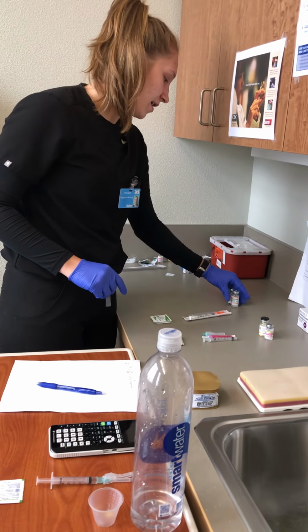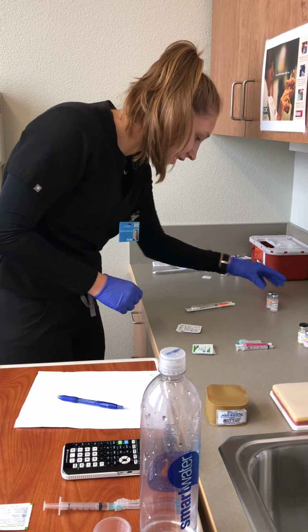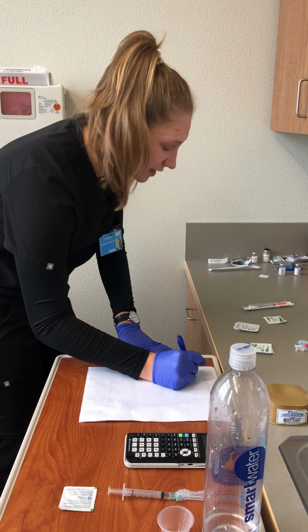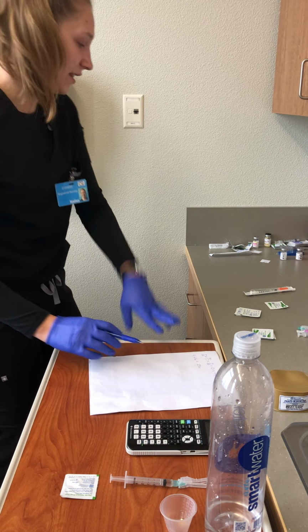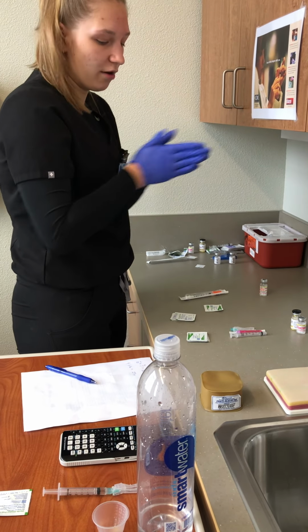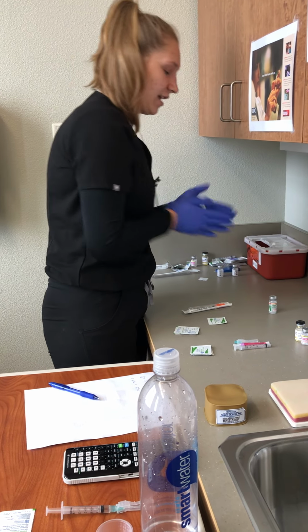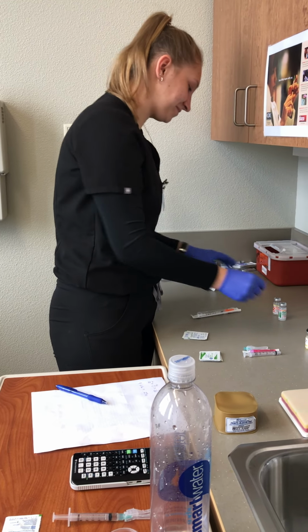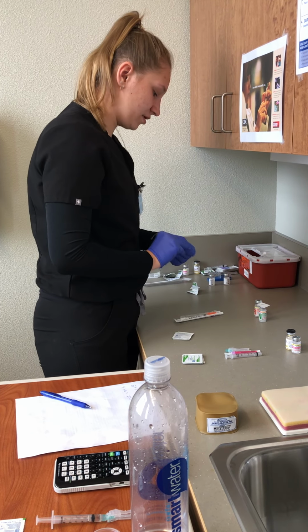Next, I'm going to be preparing my insulin. So I'm going to go ahead and double check with this and write out my math. I need 9 units of regular insulin and 16 units of NPH for a total of 25 units. And I had that math double checked with another nurse. So I'm going to go ahead and roll out my NPH vial to just get everything all mixed up good again. And for the heck of it, I'll just roll my regular insulin too. So I'm going to go ahead and wipe clean both of these with separate swabs.